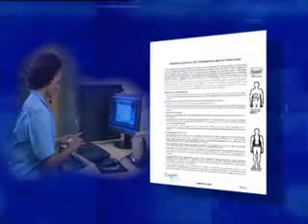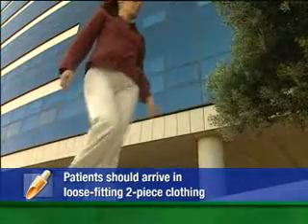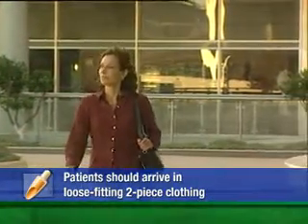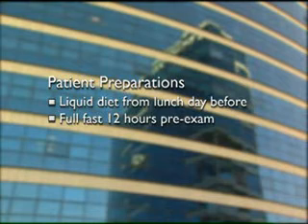To ensure that patients arrive prepared, you can give them copies of the patient instructions, which can be printed from the Rapid workstation. Instruct patients to arrive dressed in loose-fitting, two-piece clothing, and to refrain from applying lotions or powders on the abdomen. Patients must be on a liquid diet from lunchtime the day before the examination, and on a complete food and liquid fast for at least 12 hours prior.